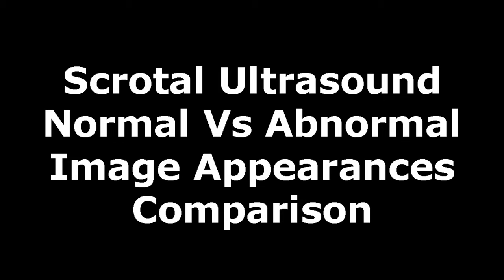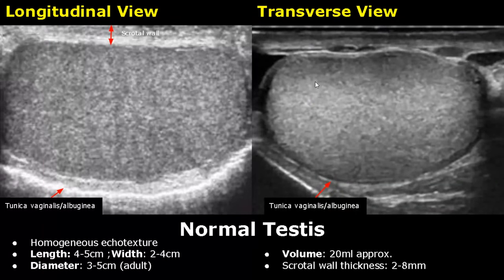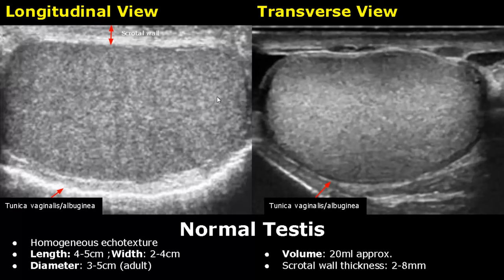Hello everyone, this is Dr. Sam, and today we will study scrotal ultrasound. We have longitudinal and transverse views of the testes. In the longitudinal view, the testes is more elongated than in the transverse view. The normal testes has a homogeneous echo texture with a medium level echogenicity. The length is between 4 to 5 centimeters, the width is between 2 to 4 centimeters, and the diameter is between 3 to 5 centimeters. Its volume is approximately 20 ml, and the scrotal wall thickness is between 2 to 8 millimeters. The tunica vaginalis and albuginea are seen together as a hyperechoic border outlining the testes.